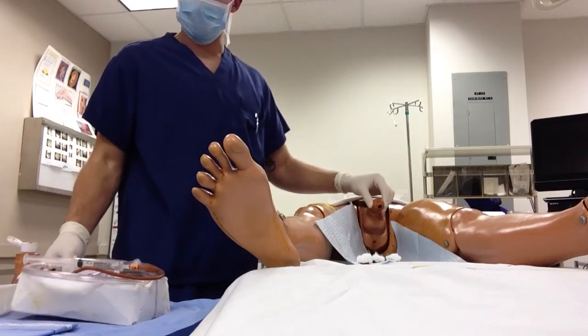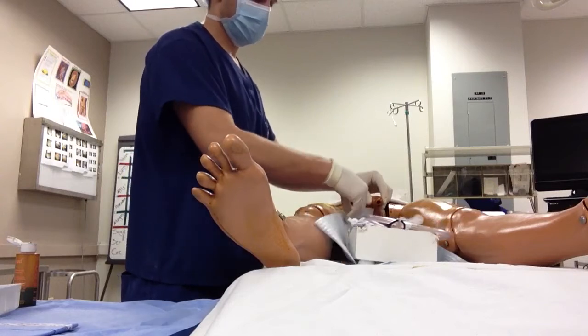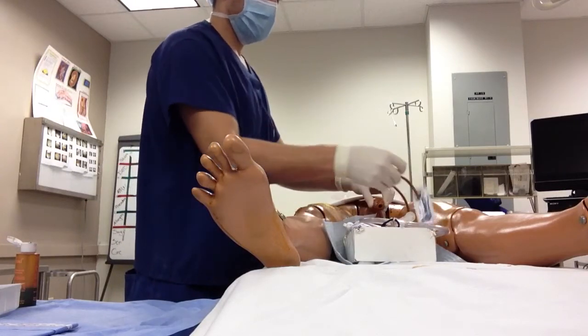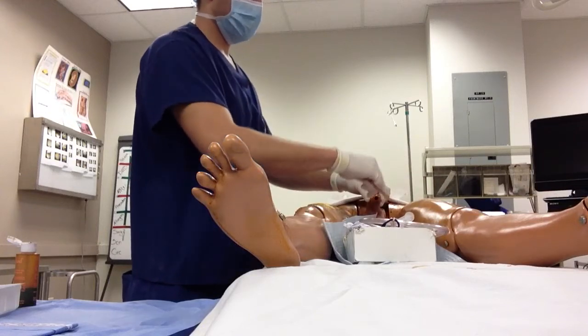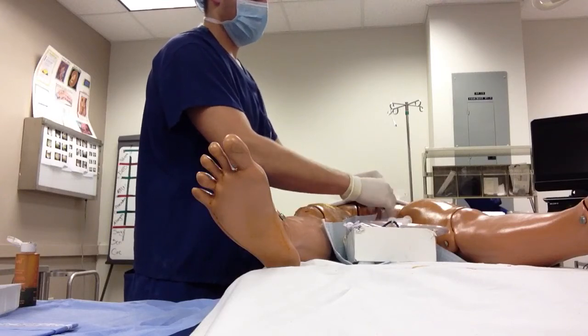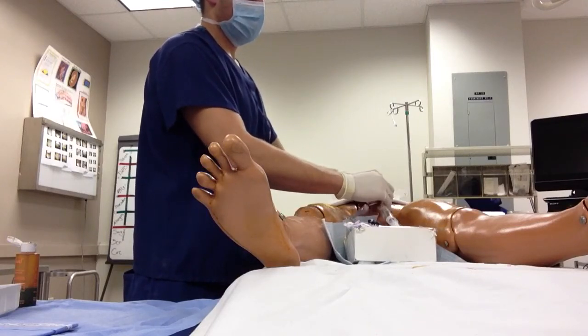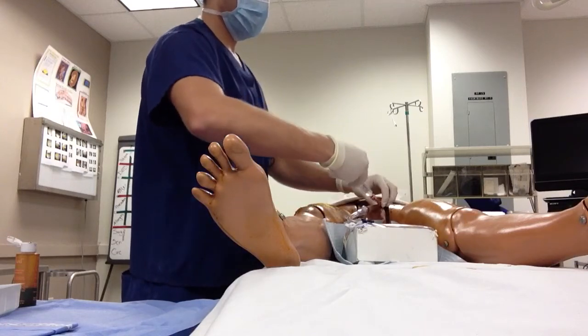Once that's done, grab your catheter, place it in between the patient's legs, take the end out of the lube, and insert it into the urethra. Slide it all the way in, then inflate the balloon so it holds in place.